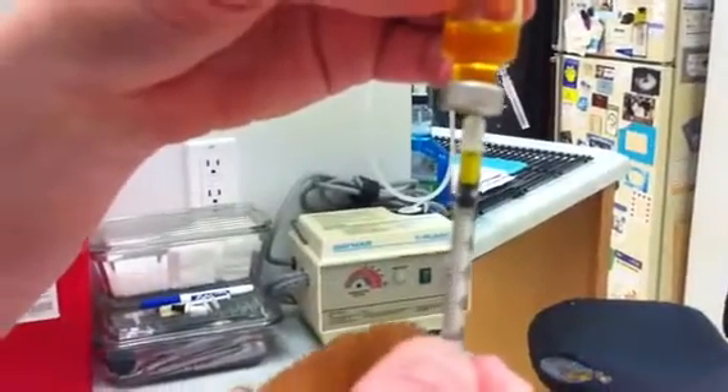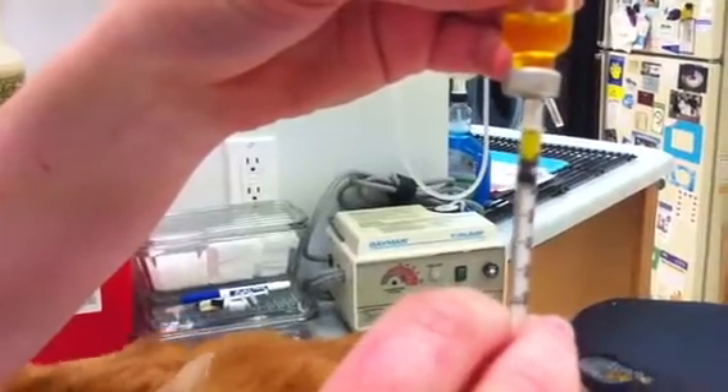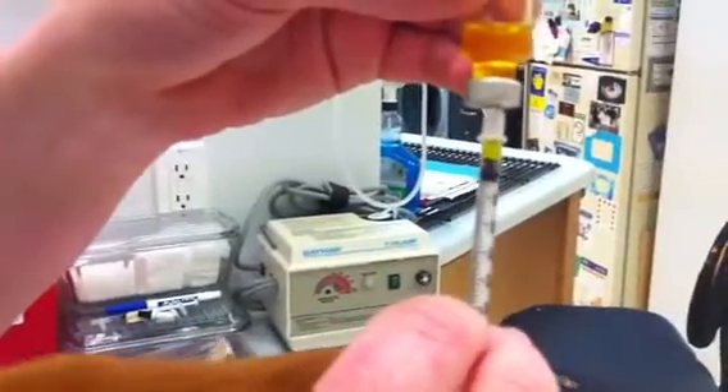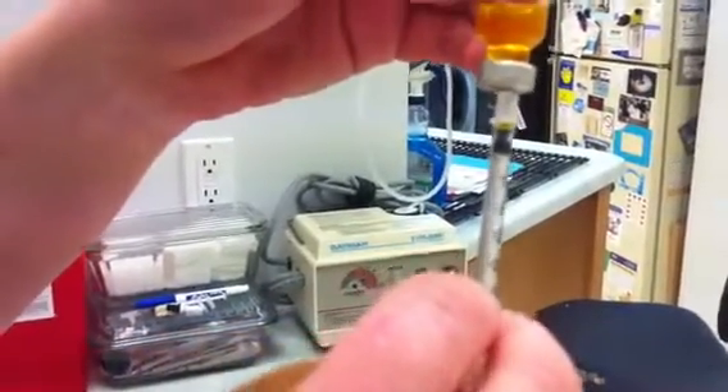Each little line is a half mark. Some insulin syringes only have whole marks. So you're counting down from five — four, three, two — one unit of insulin is usually a starting point for most kitties.